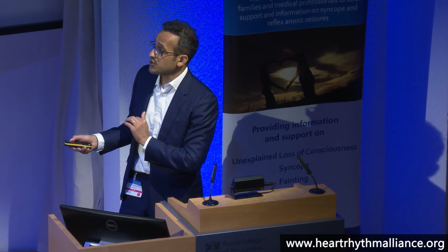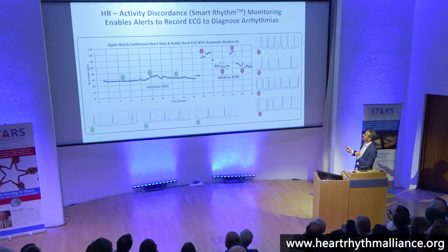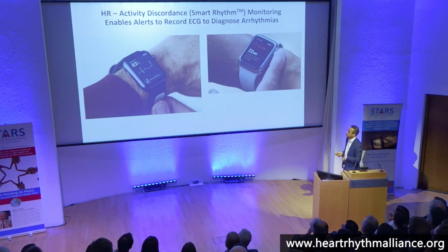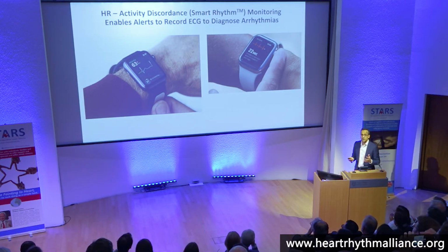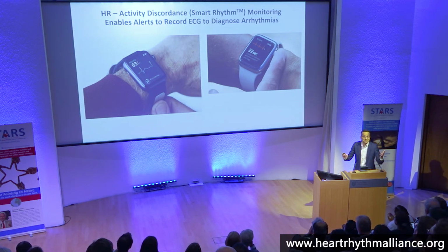And again, this is based purely on atrial fibrillation algorithms. What it will do is look at your beat-to-beat variation, and if it is stable, it will do nothing. If it achieves a really big change in your RR variation, which is incompatible with your GPS location and what you're doing, okay, it'll alert you and ask you to record an ECG. Okay, and that's usually by 2 electrodes, here and here. Okay. I don't think there's any basis for investigating vasovagal syncope unless they can get some real-time continuous monitoring. But I was asked to tell you about it, so here it is.